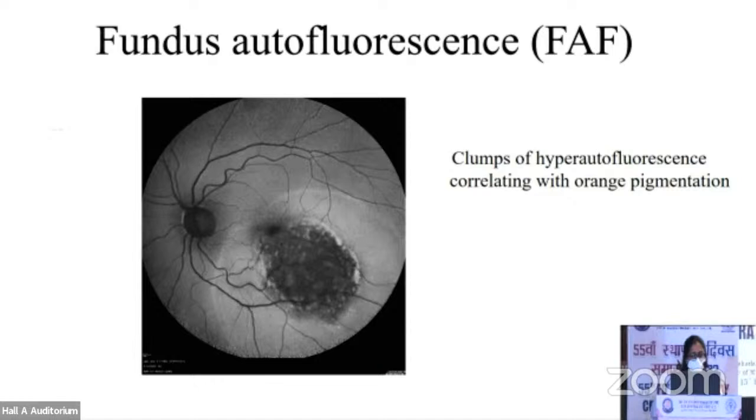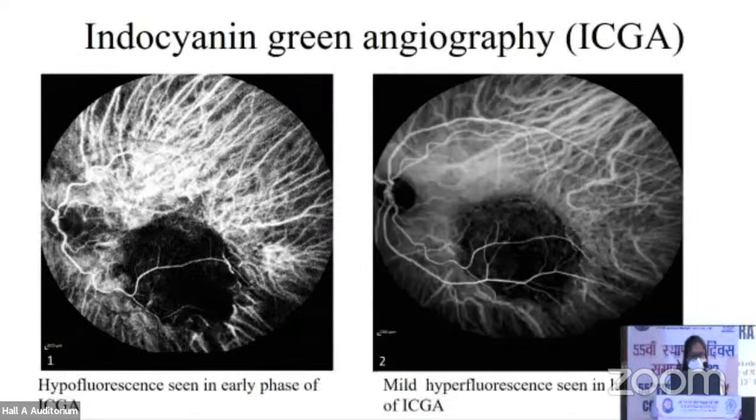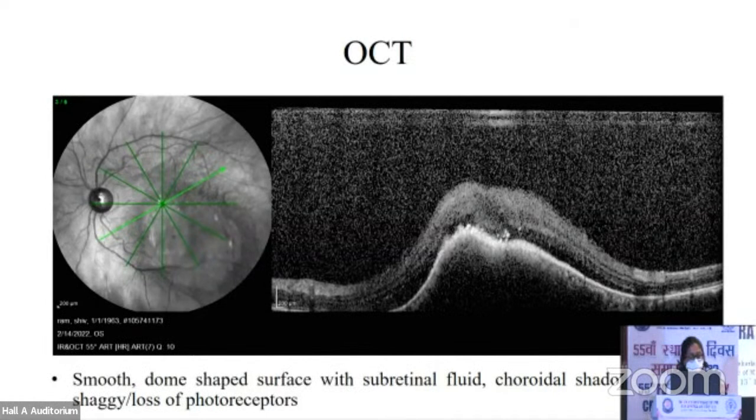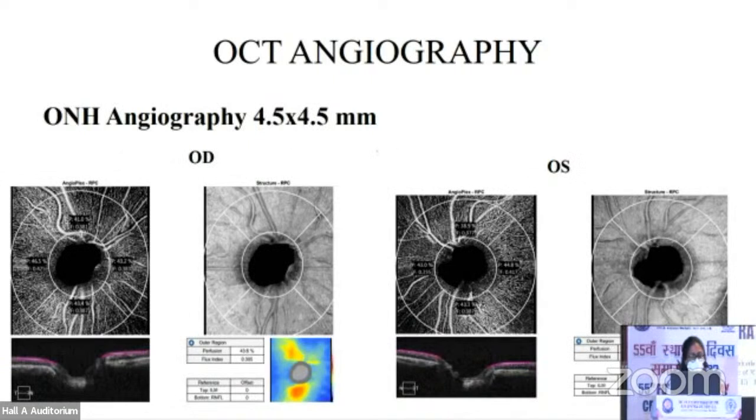FFA of the left eye showed patchy hypofluorescence in the early phase with staining and leakage in the late phase. ICG of the left eye showed hypofluorescence in the early phase with mild hyperfluorescence in the late phase. The OCT image of the mass showed a dome-shaped surface with subretinal fluid and a shaggy surface with loss of photoreceptors underneath it. These are the baseline images of both right and left eye macular OCT angiography, 6 into 6 mm, and optic nerve angiography of 4.5 into 4.5 mm, which help in further follow-up of the patient.